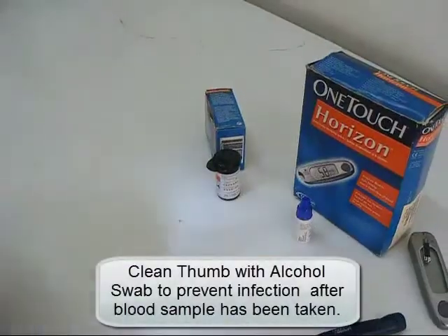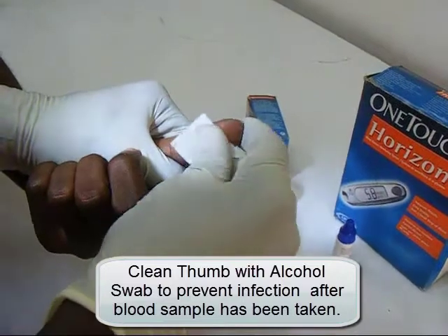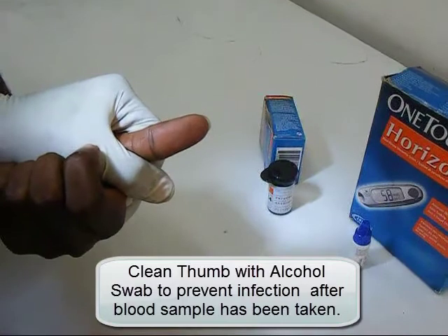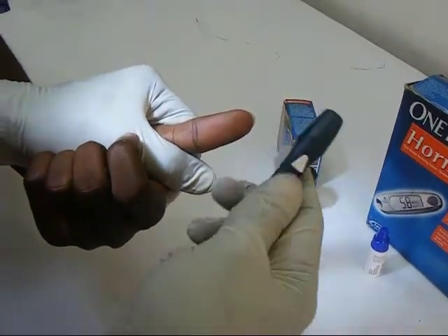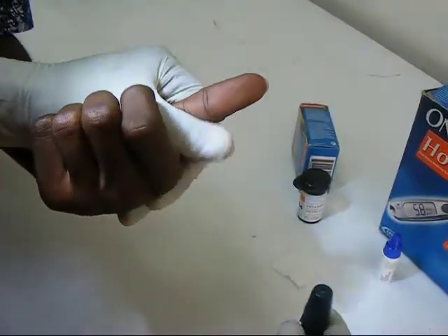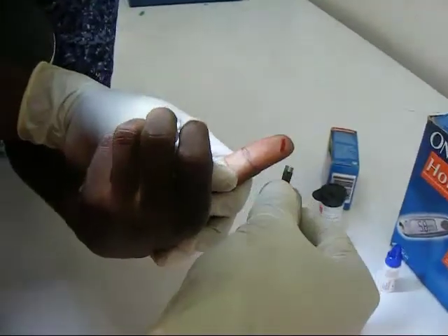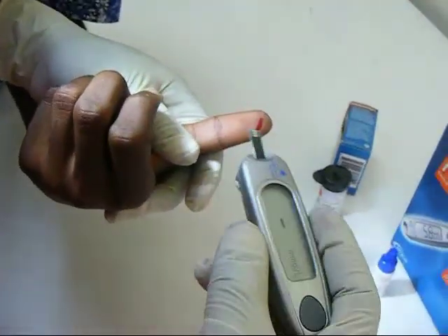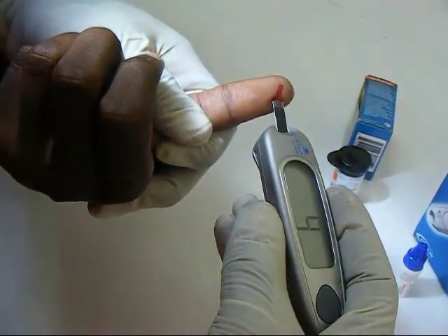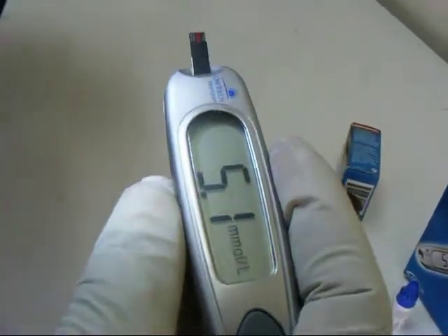The lancet is used to prick the tip of the thumb, and the blood is collected with the test strip. The blood glucose concentration is then displayed on the meter after a few seconds.